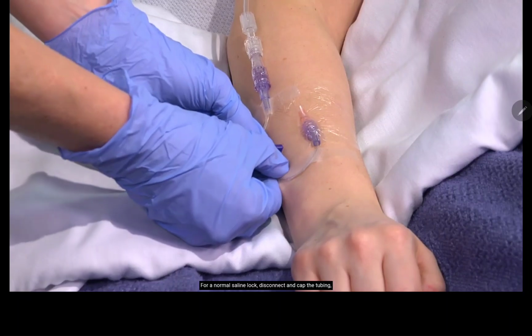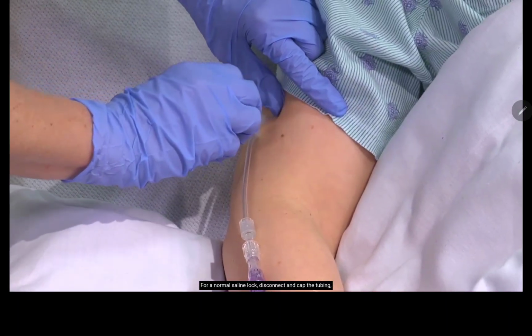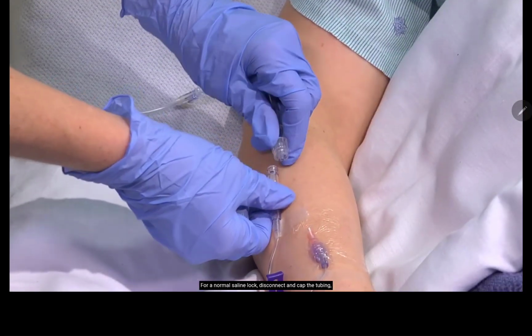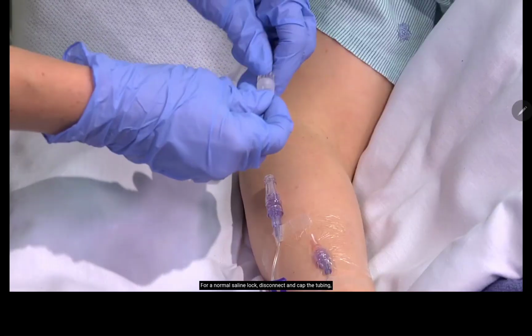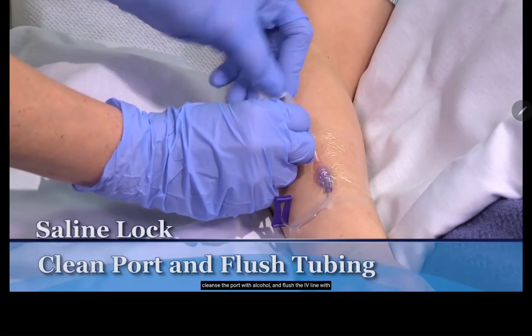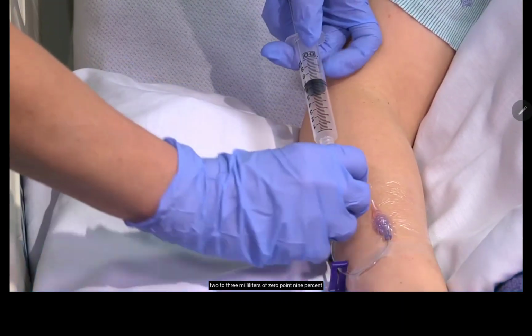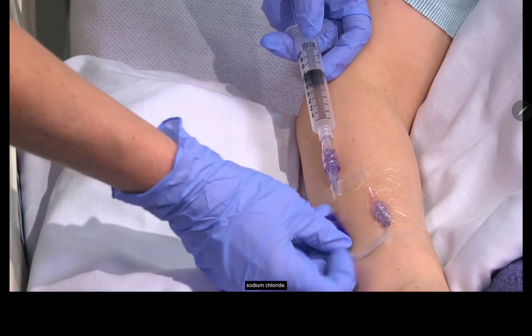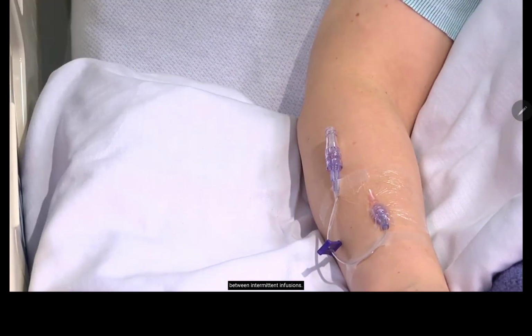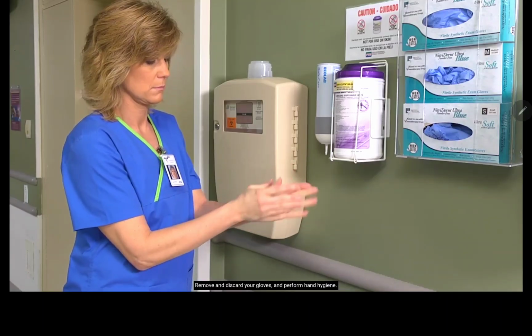For a normal saline lock, disconnect and cap the tubing. Cleanse the port with alcohol and flush the IV line with 2 to 3 milliliters of 0.9% sodium chloride. Be sure to keep the IV tubing sterile between intermittent infusions. Remove and discard your gloves and perform hand hygiene.